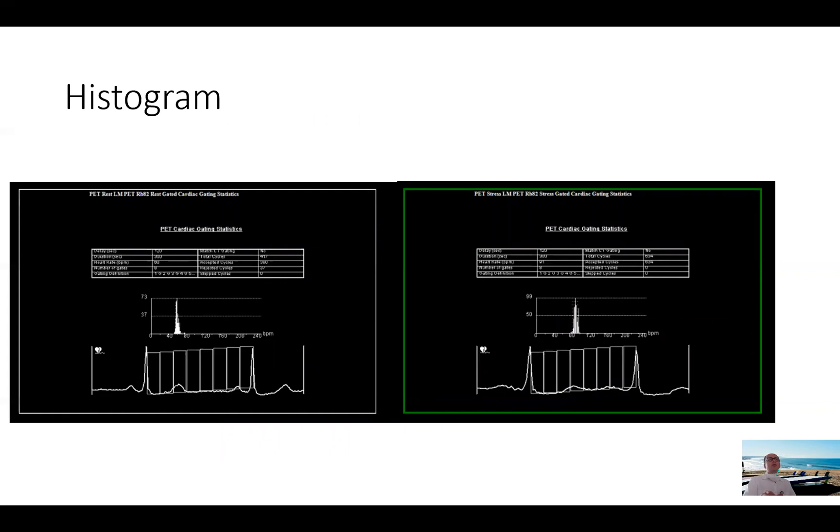One other thing we look at before we move on to look at the gated images is to look at the histogram to make sure that we capture the images for the gated images all within some reasonable heart rate without extra ectopy. This is a difficult problem to deal with after the fact, especially with PET because of the short half-life of rubidium. So you want to make sure that this is correctly acquired at a stable heart rate. On the left hand side of the screen, you can see this is the rest images where the heart rate was almost 70 with a very narrow tight histogram. And similarly here, post-stress, the heart rate went up as expected with regadenoson to about 80-85, again with a very narrow histogram.